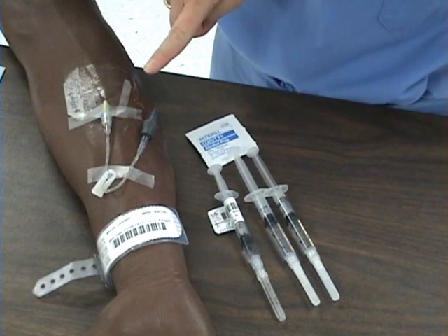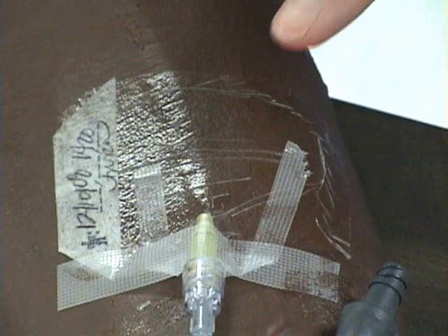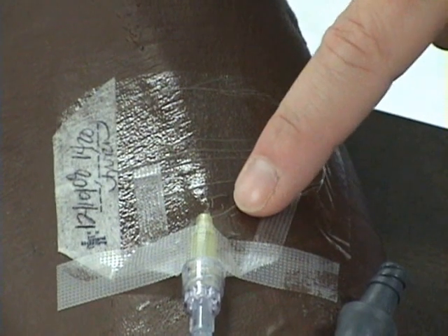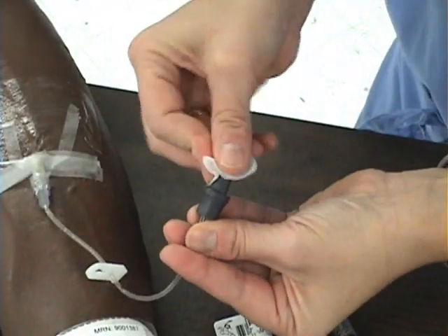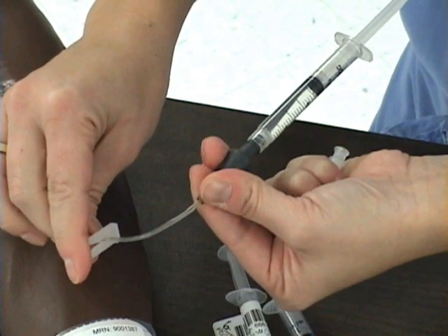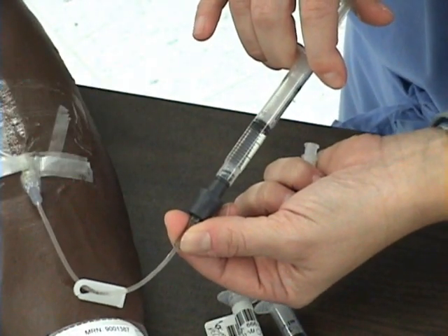Before administering the medication, I want to check the IV site. I see no evidence of infection, infiltration, or phlebitis at the IV site. The patient does not report any pain. I will swipe the port with alcohol. I'll attach my saline flush by twisting and then unlock the clamp. I will flush slowly and check with my patient to see if he is having any pain.